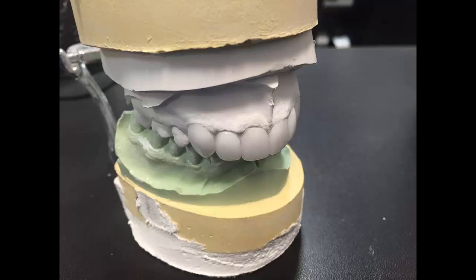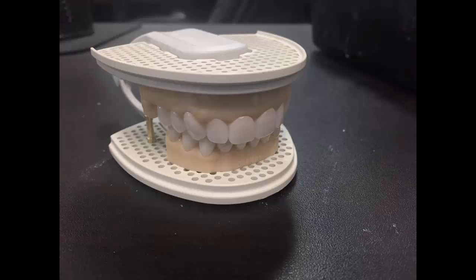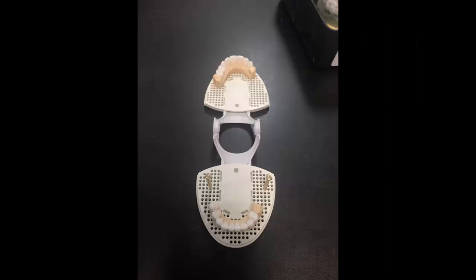This is a full arch that we decided to just mill out in one whole piece. Once we put it on there, we add a little bit of shine to it — you can choose that depending on whether you're going to make a putty or if this is a presentation, then you can add some gloss. We get Serac Connect cases all the time and they just want us to do wax-ups and send it back. If we had virtual preps, that would be awesome.